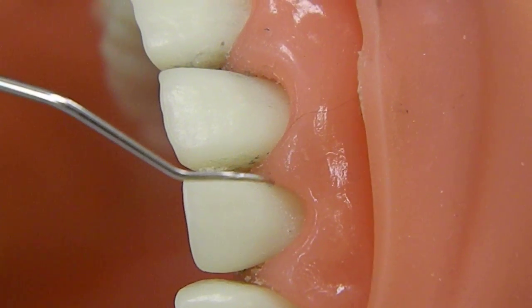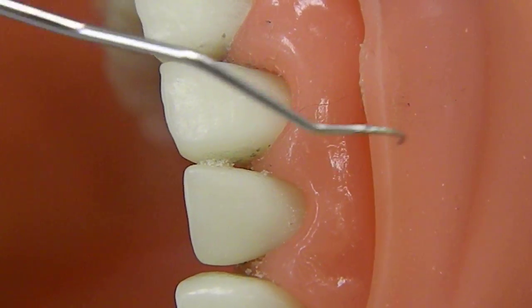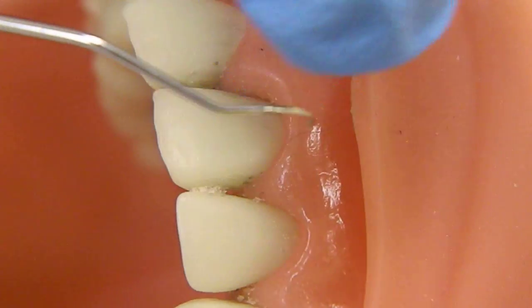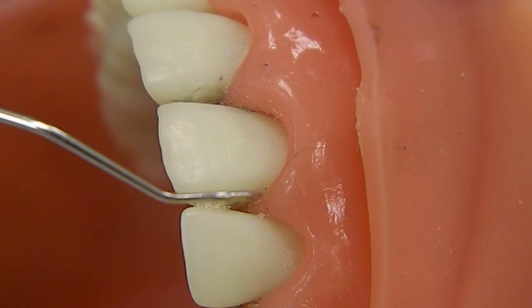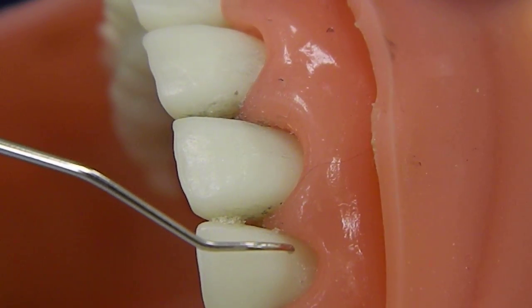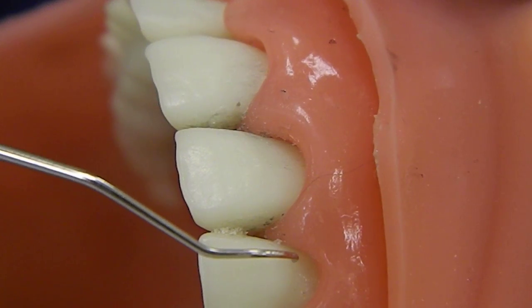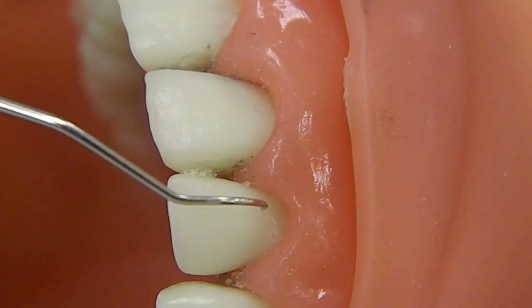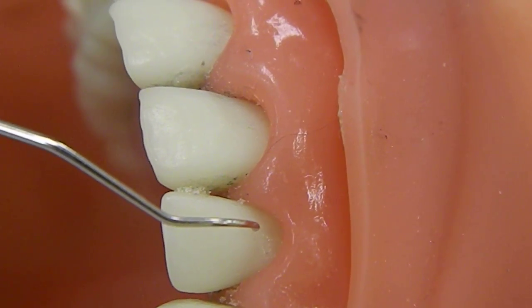So if we're looking here at number 10, this is the long axis of the root. This is the terminal shank. So I'm going to be looking at the terminal shank. I'm going to be placing the tip of the instrument without activating it on the tooth. And here you can see that it's parallel with the long axis of the root.